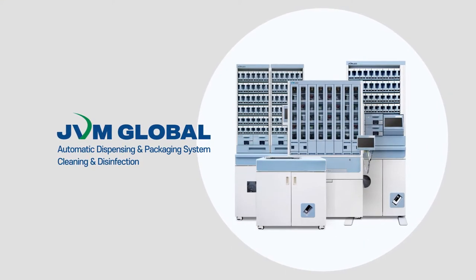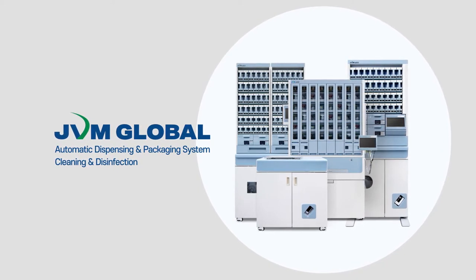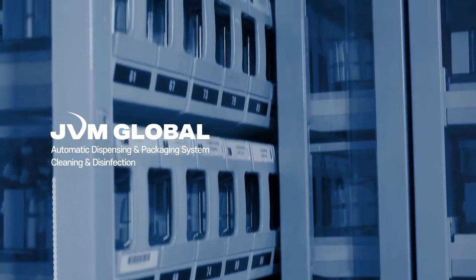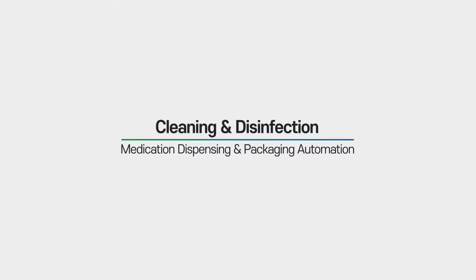Cleaning and disinfection of a medical device are a key factor to infection control in the medical facility. This video will show you how to effectively clean the JVM automated tablet dispensing and packaging system. You may use the same method for other JVM machines as well.